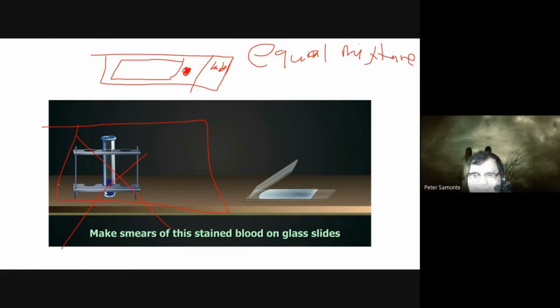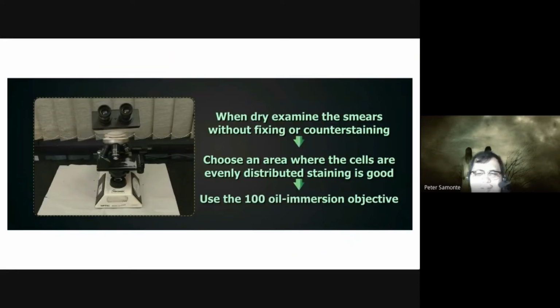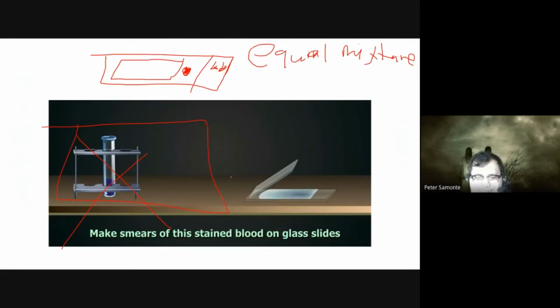Okay. Tuloy tayo. Okay, when dry examining the smears without fixing or counter-staining, choose an area where the cells are evenly distributed and staining is good. Okay, balik pala tayo dito, class. I forgot to explain something. Counter-staining, class.